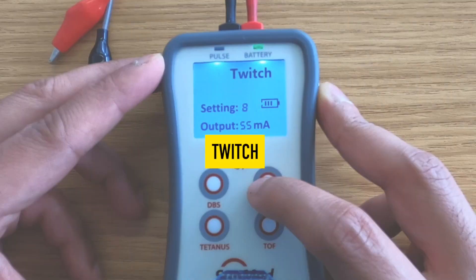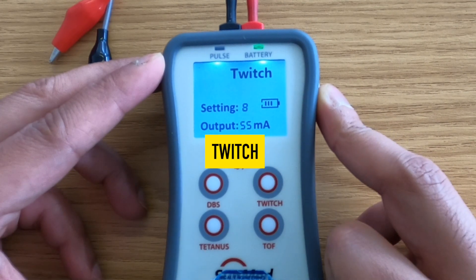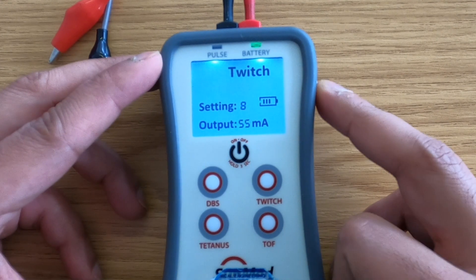Twitch: this produces twitch stimulation. When pressed and held down, it is automatically repeated one pulse per second until the button is released. This button can be turned off by pressing the DBS or train of four buttons.